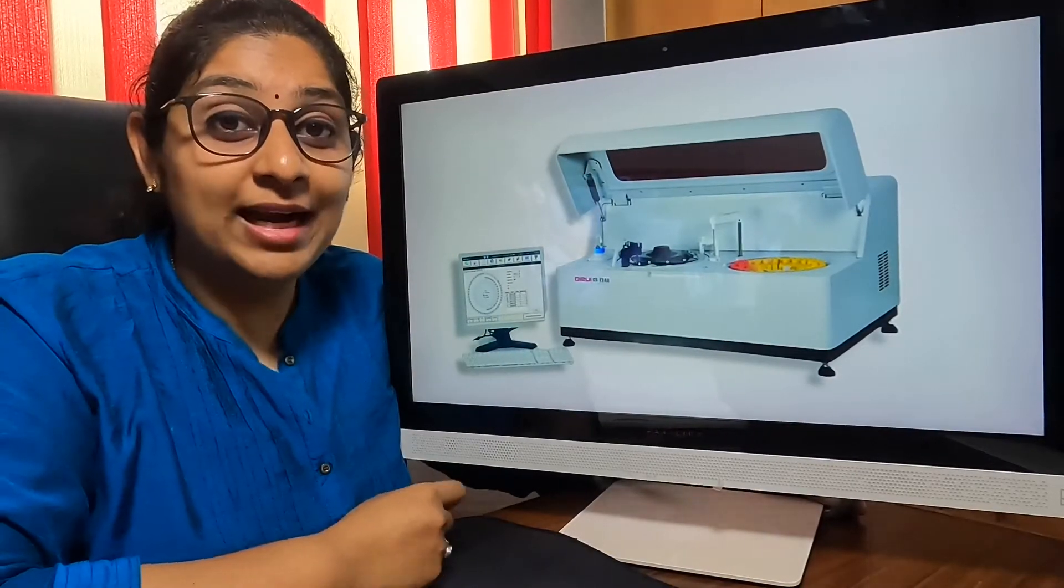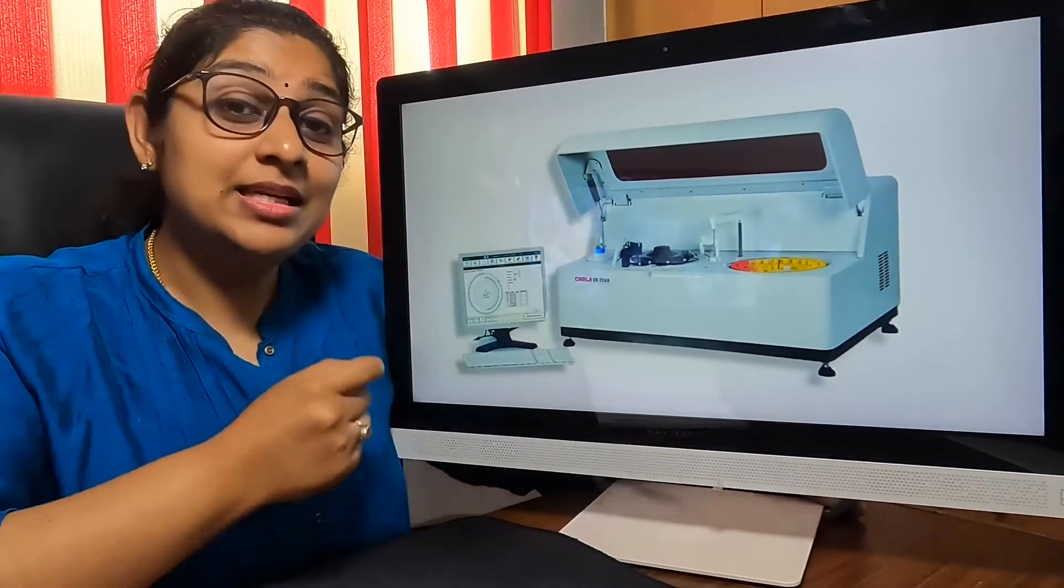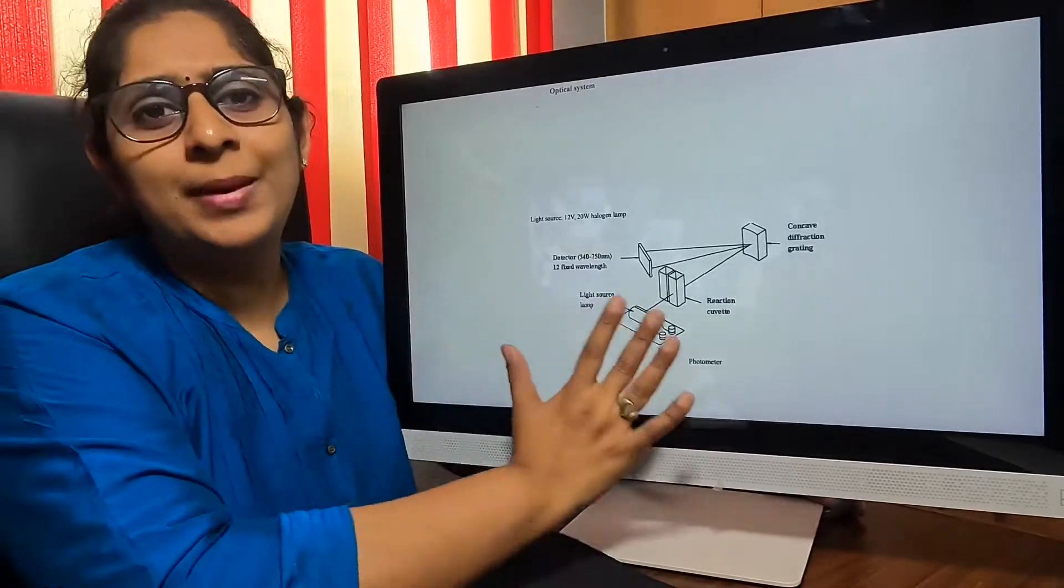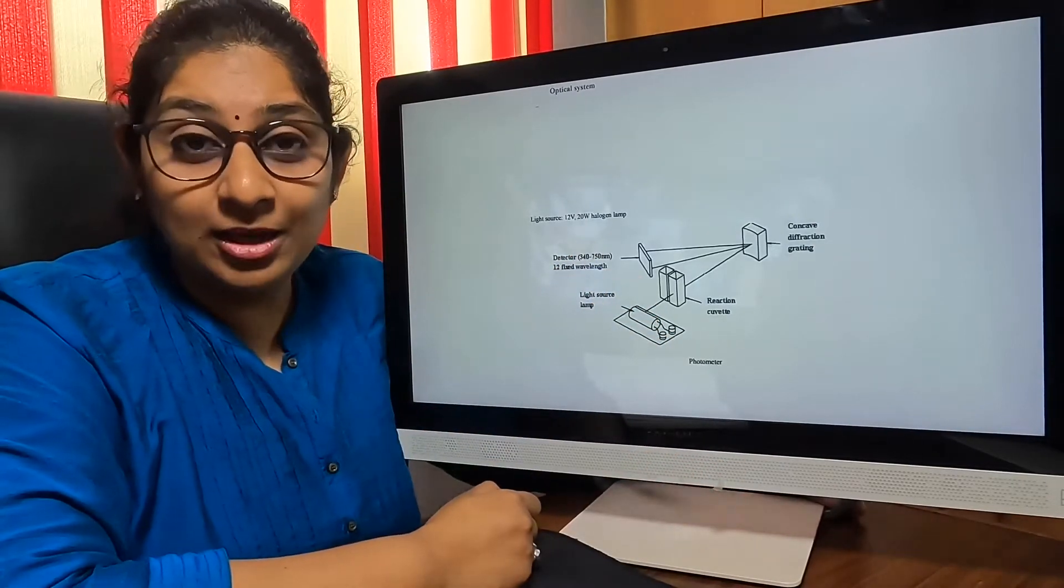More importantly, we have to note that this machine can simultaneously analyze about 60 colorimetric items at one go. This is the basic principle of the DIRUI CST240 biochemistry analyzer.